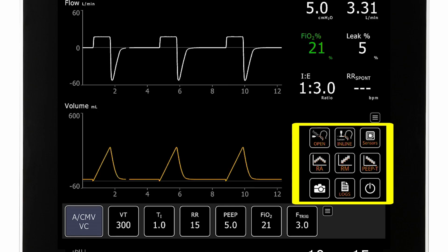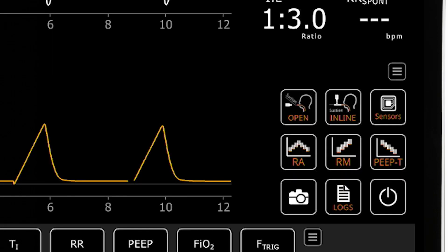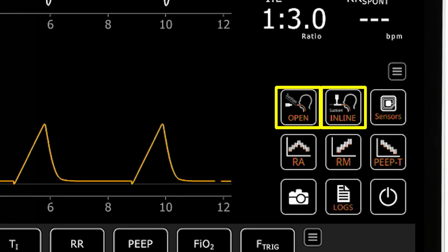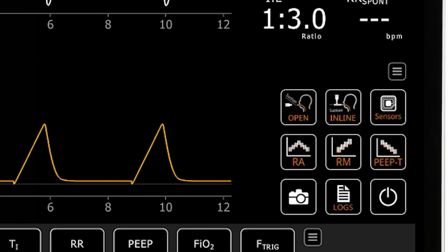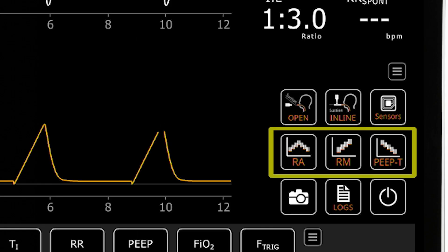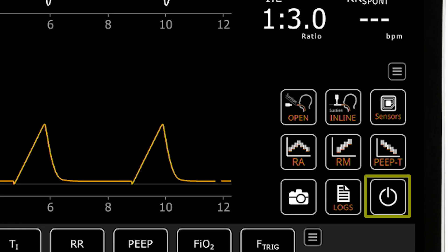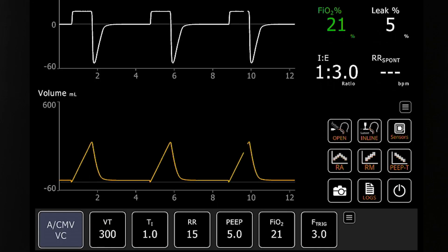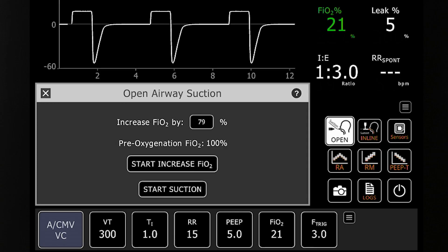The apps area provides access to programs designed to assist clinicians in the care of their ventilated patients, such as in-line or open suctioning, weaning measures such as P0.1 or NIF, additional monitoring such as volumetric capnography or transpulmonary pressure, various lung recruitment processes, and the standby function. Selecting an app opens the app dialog box, and on-screen instructions guide the clinician in the use of each app.